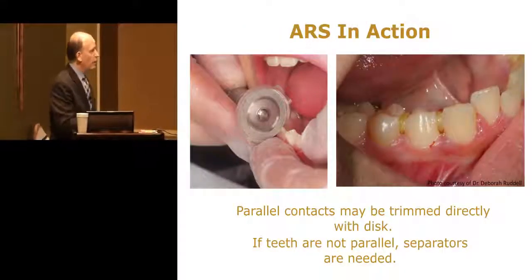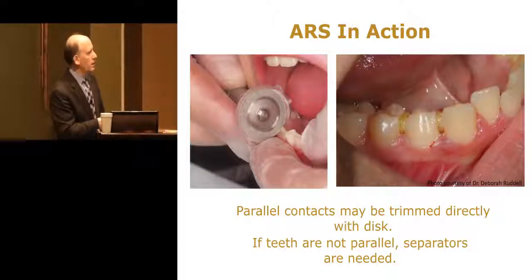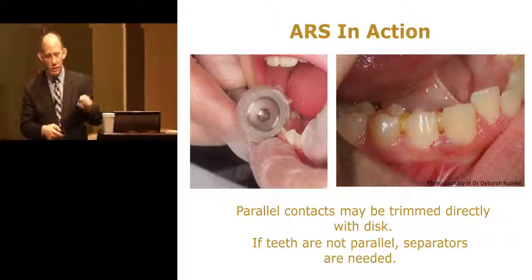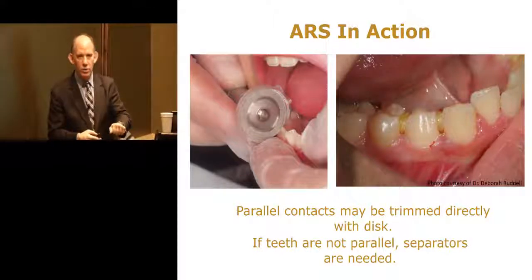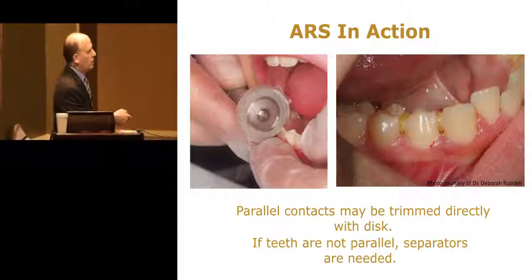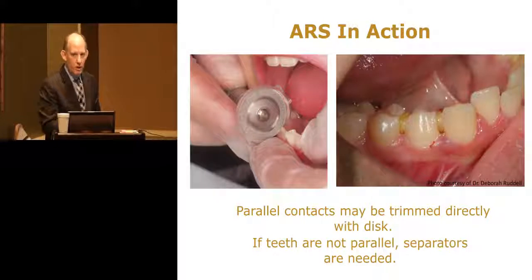Okay, so again, here's my double-sided ultra flexible disc, going through a tight little contact. And you can see this is a very real shot in my office where I've got one hand retracting the lip, and the other hand holding the nose cone of the handpiece, and I'm really forcing this plastic guard right into the face here, so in case it grabs and skips, it throws the guard into the tooth surface and it can't really go anywhere.